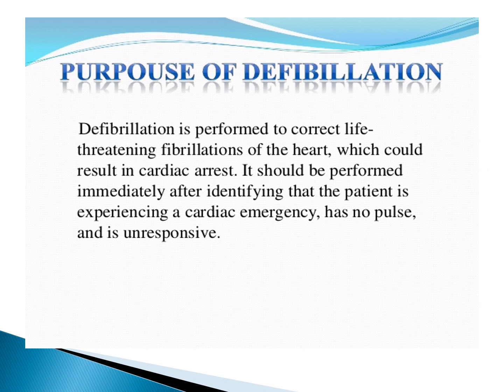The purpose of defibrillation is to correct life-threatening fibrillations of the heart, which could result in cardiac arrest. It should be performed immediately after identifying the patient's emergency, and we should check the patient's pulse and responsiveness.